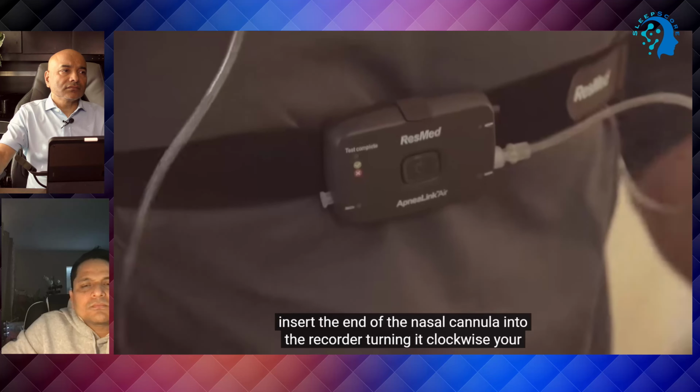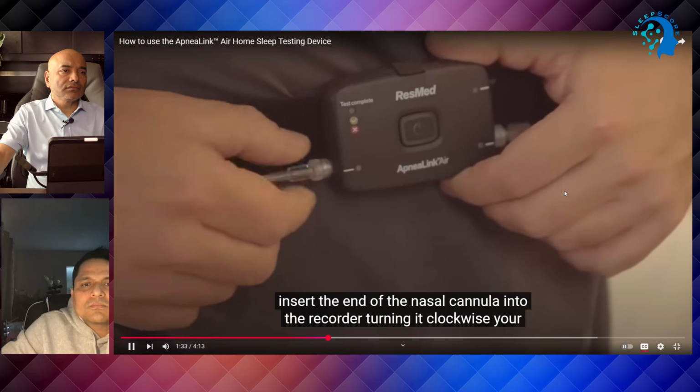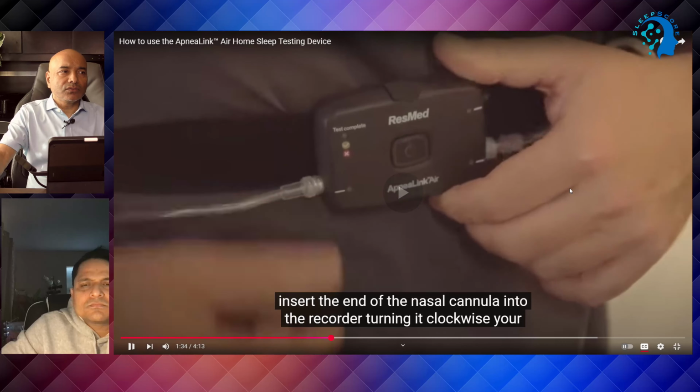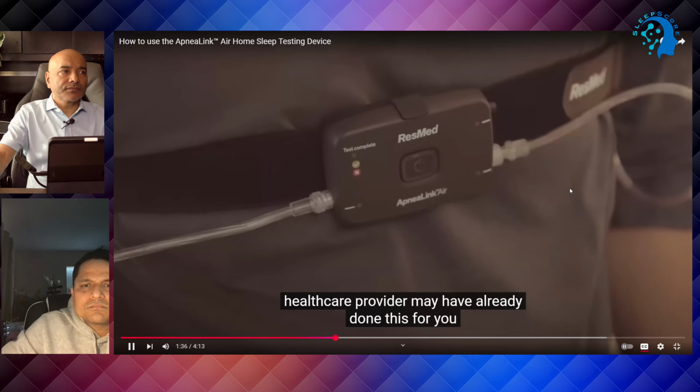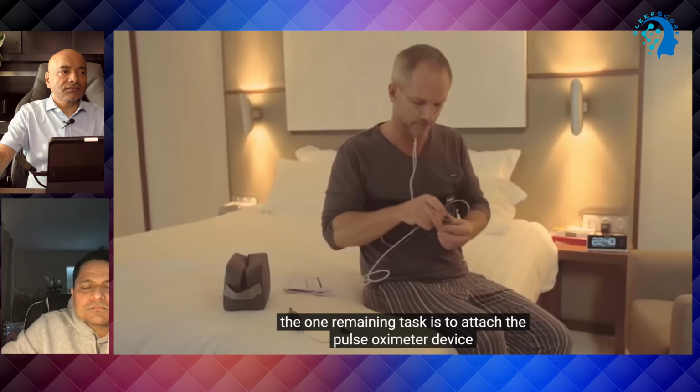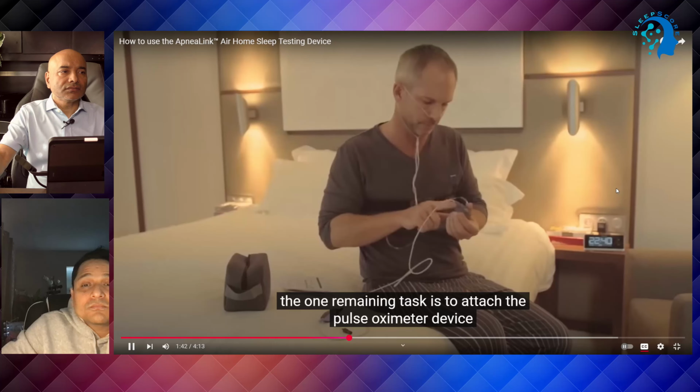Insert the end of the nasal cannula into the recorder, turning it clockwise. So this home sleep study device is connected mainly with the nasal cannula device and another one also. Your healthcare provider may have already done this for you. The one remaining task is to attach the pulse oximeter device.